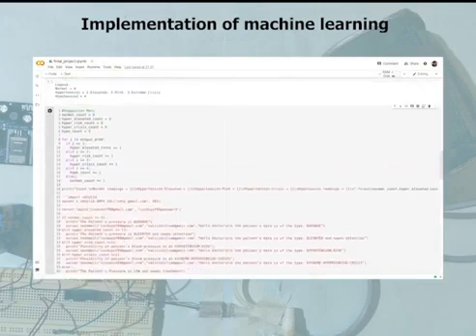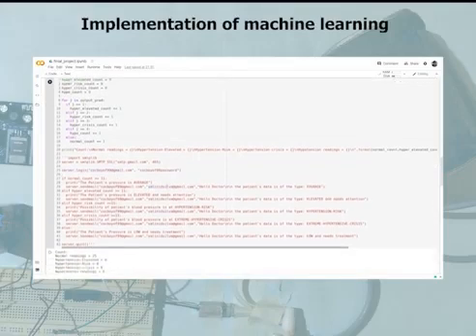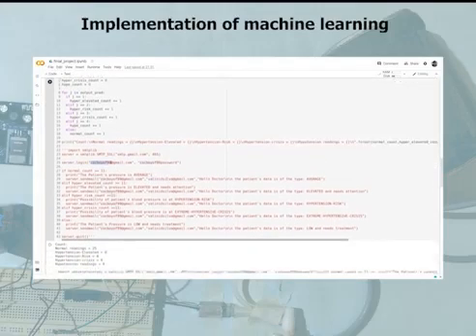This is the part where the mail gets sent to the doctor. COC boy of 99 is a sender email and valenidisilva@gmail.com is the receiver's email. The script uses COC boy of 99 to send email to valenidisilva@gmail.com, and in this mail the output of the patient is sent. In this case, the patient's data will be sent as average because Rohit.csv contains all the values of that of a normal patient.